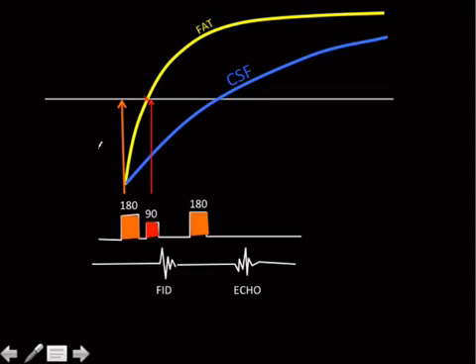Well, the inversion time of gadolinium is pretty close to the inversion time of fat. So if you did a STIR on somebody that had GAD, you would null the fat, but you would also null anything that enhanced. So you never see a contrast enhanced STIR. Now we do fat suppression all the time with contrast enhancement, but it's a different type of fat suppression. It's not STIR.